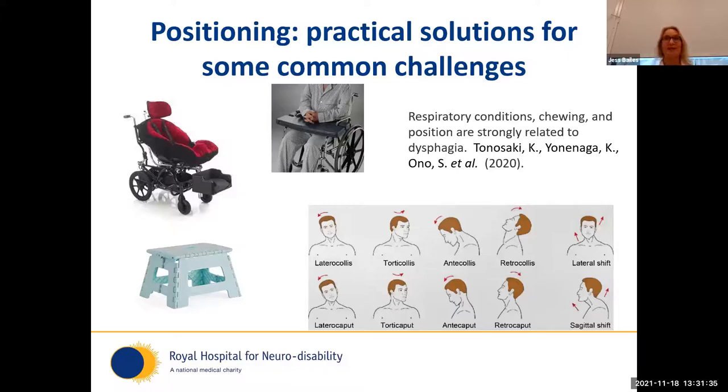Some of the chairs we have here are really large. If you're quite small like me, I can highly recommend a step stool to help you get in a good position for your FEES. We can also think about in something like videofluoroscopy, where the size of the chair might be difficult in the space.